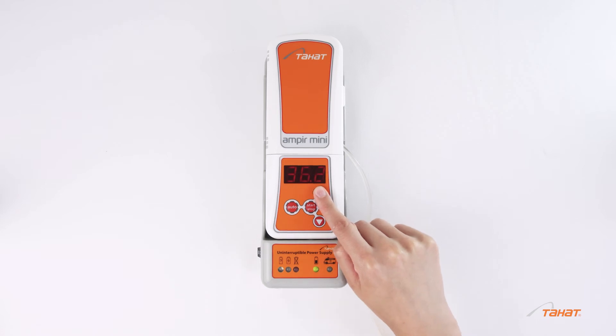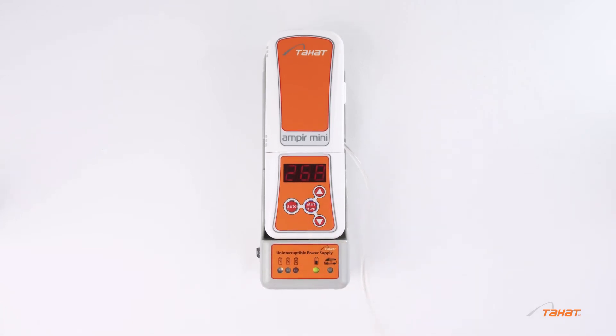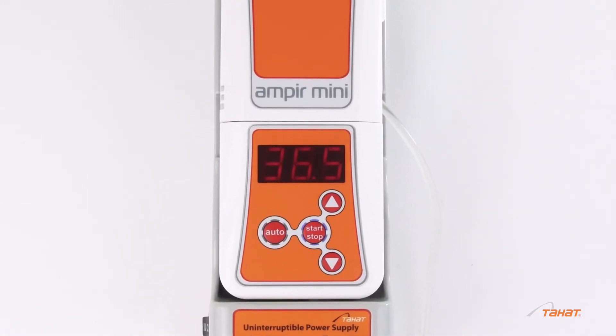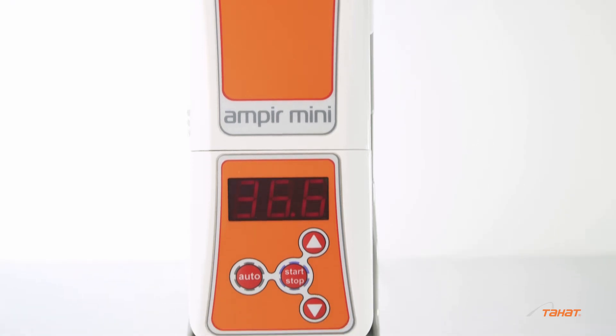Working in manual mode, set the required temperature and press the start button. Warming will take about 3 minutes. Manual mode allows you to set the temperature in the range of 34 to 42 degrees Celsius. The current temperature of the heat exchanger will be displayed.